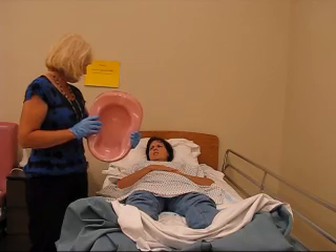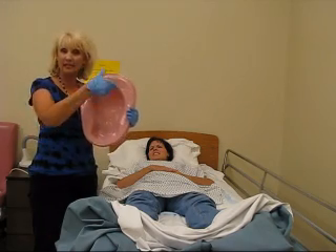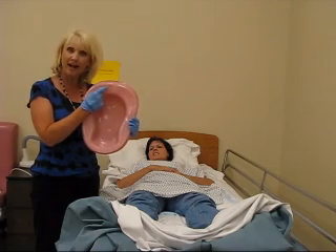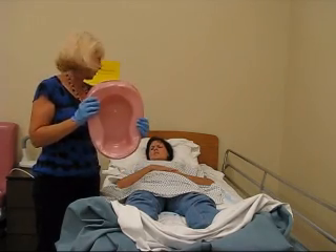Your what? I keep my candy in there. Oh, okay. I might dump it out. This is the regular bedpan. You can see it's shaped like a little toilet seat. There's a little crack here to remind us that the crack goes on the crack. We would not want to put it this way under Mrs. Lindsay because that would be very, very uncomfortable for her. Oh yes, and she needs to go badly, so we're going to do it now.